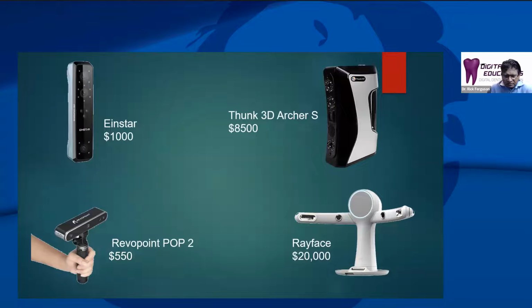And I'll go through starting with the RevoPoint Pop 2. We did use the original version of RevoPoint, the Pop 1. Not as good as the second version, so we don't use that anymore. But this is probably the lowest cost face scanner, I think, that you can use for doing any of these types of workflows. It's around $550, and the theoretical resolution is about 0.1 millimeters.